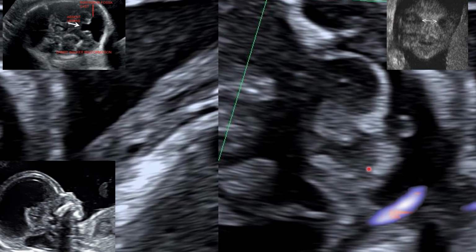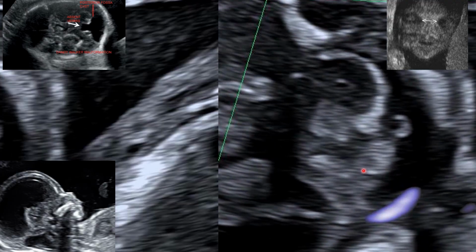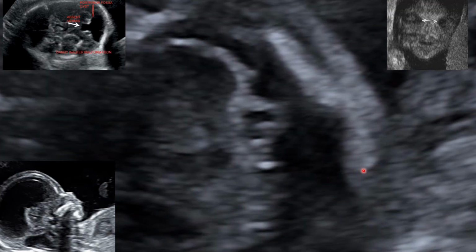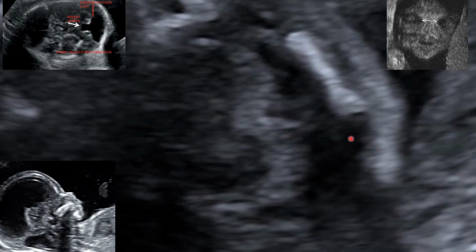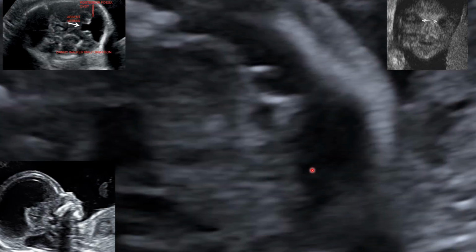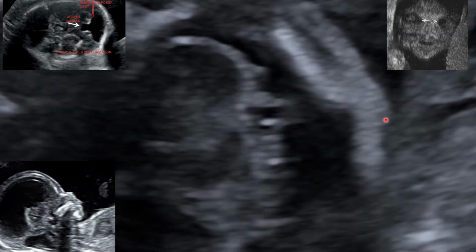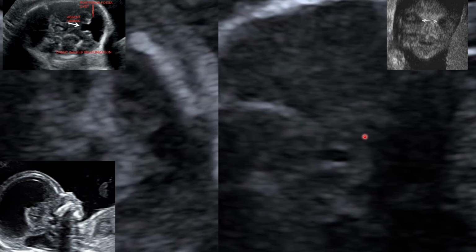I hope you are following. We will keep on doing regional assessment in the second trimester during the anatomy or anomaly scan to make sure that you master what we check. For some people, they just know that there's an anomaly scan, but they don't know what to check.